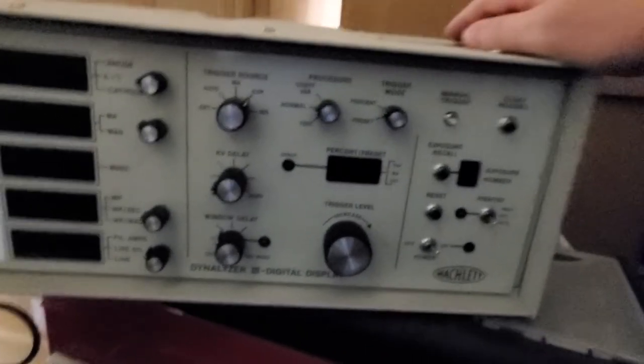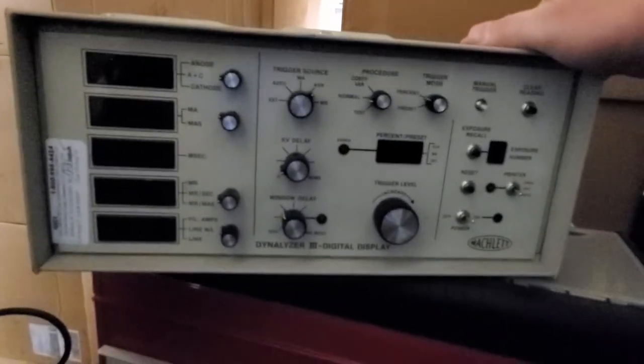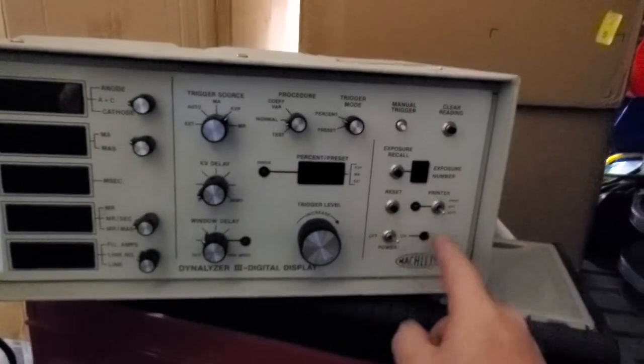Now back when I first got started in biomed, these were a thing — that was 20 years ago, and I think they were on their way out 20 years ago. So that means this guy is probably about 30 years old. I bet you it powers right up too.